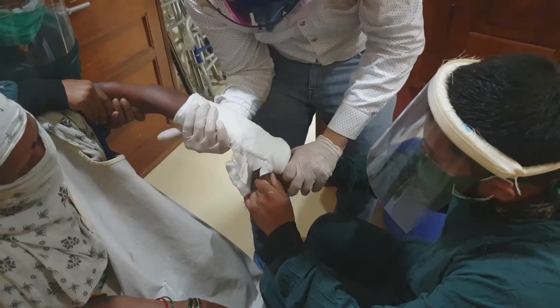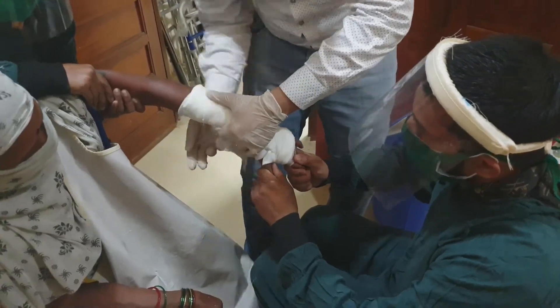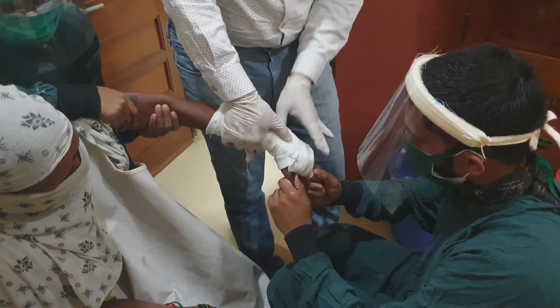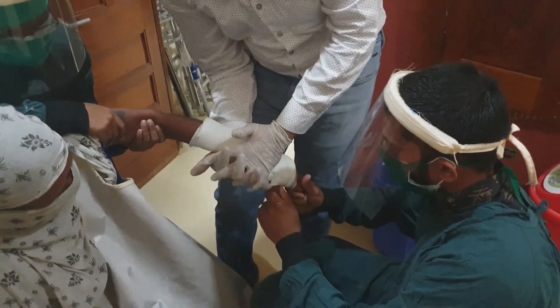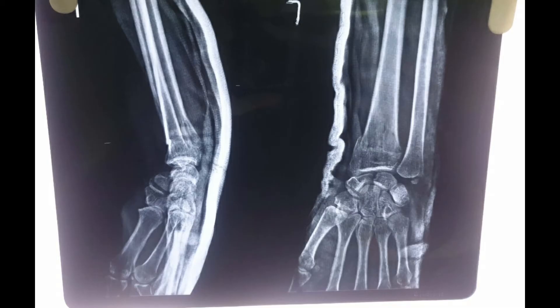I always advocate the use of a plaster splint for four to five weeks, followed by a brace. If you carefully select the fracture and use cast, you will get good results and movement. Always keep the cast in position until it dries. If you can aim for even just neutral in the volar-dorsal direction, the results will be fine. Thank you.